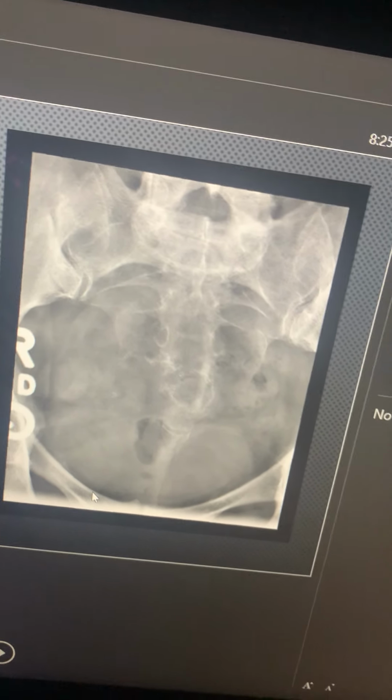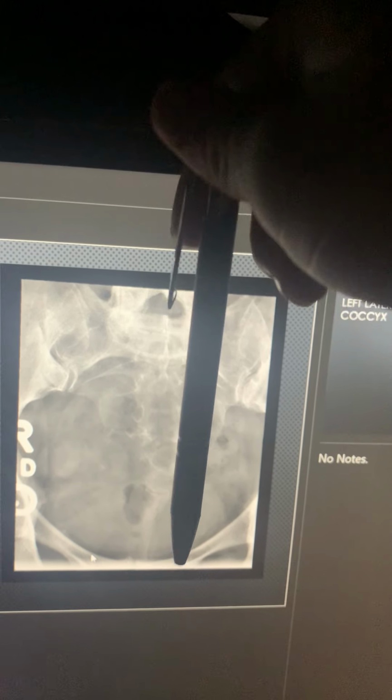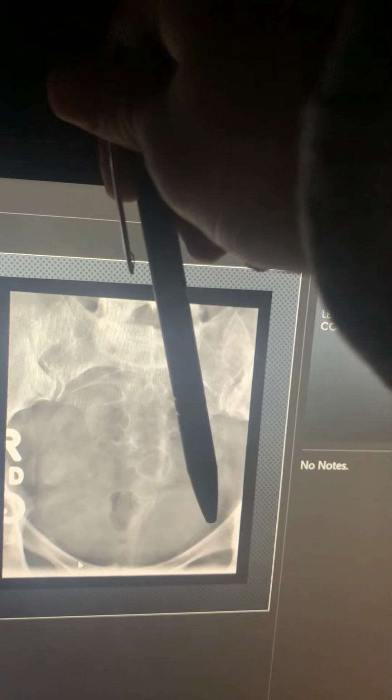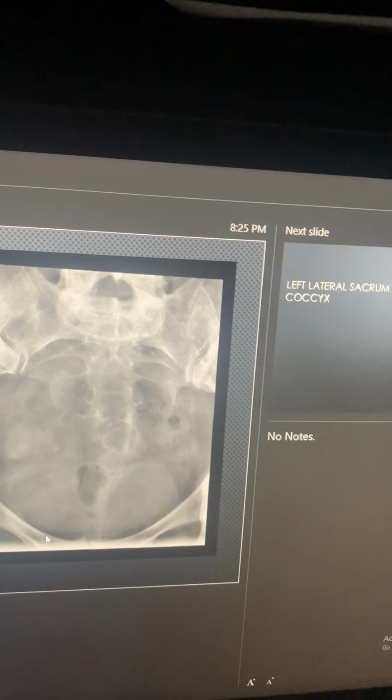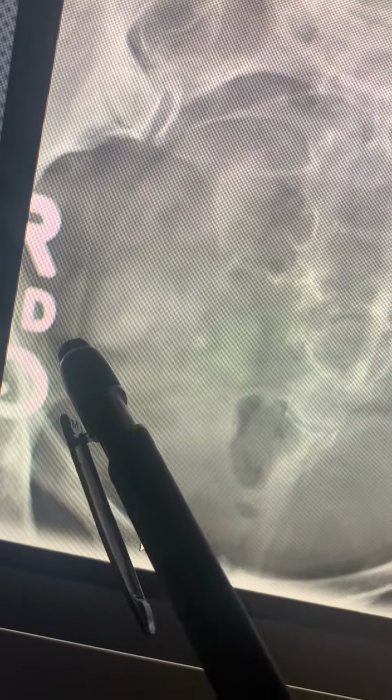This is our AP axial coccyx. Also, another fun, joyous fact, our tube angulation was completely broken, so I had to completely eyeball it. But it looked like 15, and then it did look like 10 degrees. So everything came out just as we needed. So eyeballing it isn't the worst thing. Marker placed right side, lateral of the patient and lateral of the anatomy that we needed.